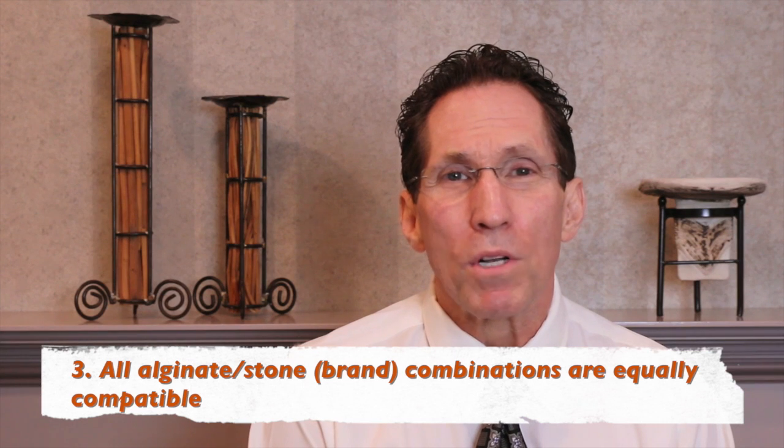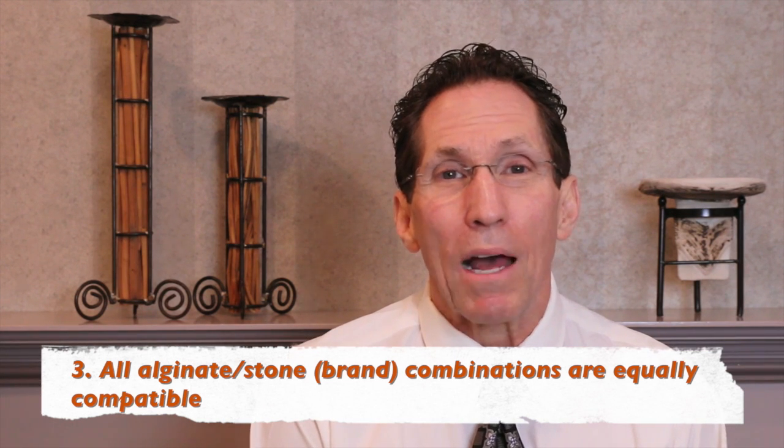You know, we're going to talk about having control over our viscosities, our setting times, and we're going to use the water temperature to control one of those variables. And then finally, we're going to talk about the importance of the interaction between the alginates and stones.